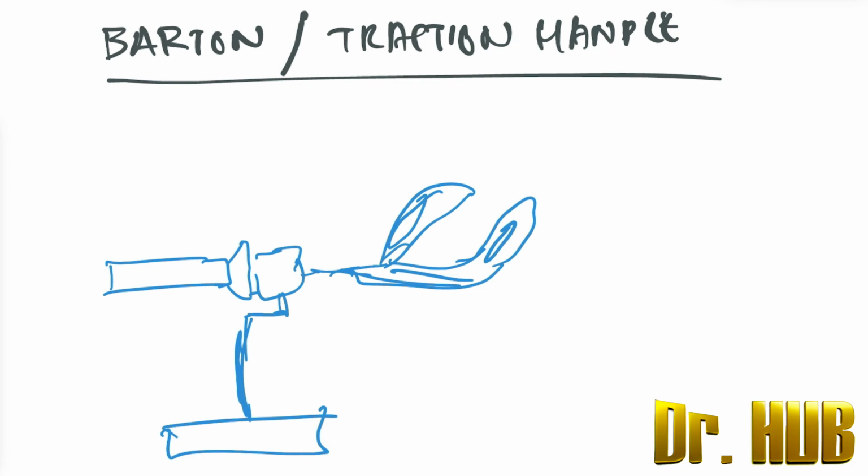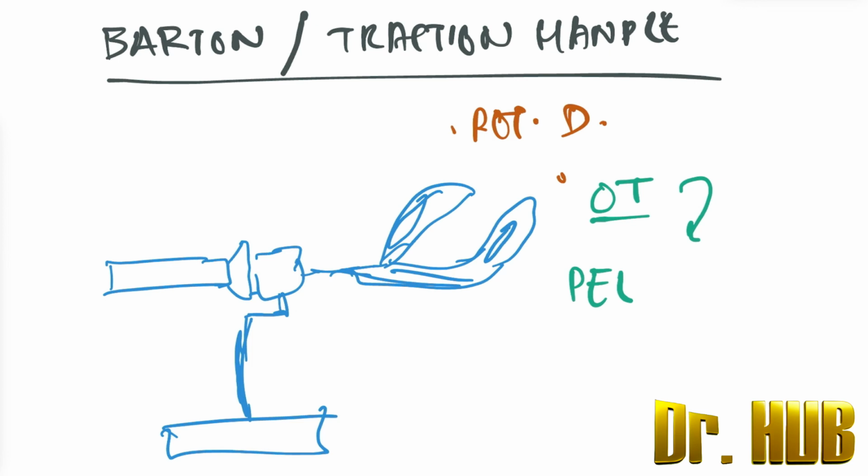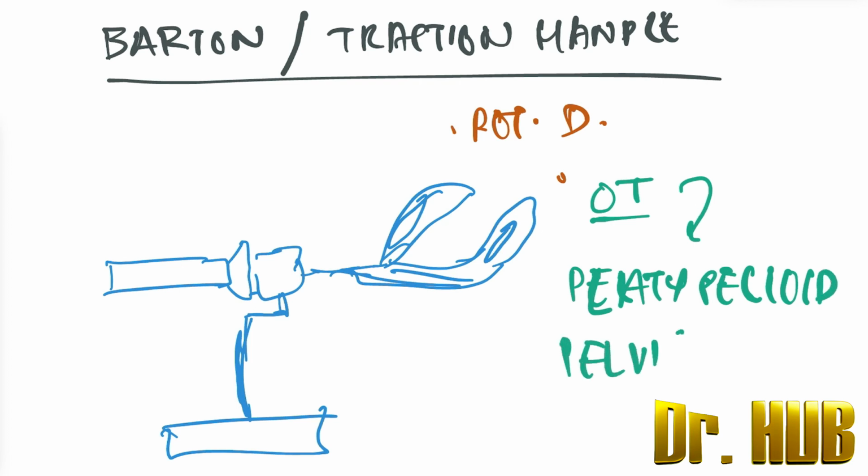It is used for rotational delivery, and it is most importantly used for the delivery of occipitotransverse positions in the platypelloid pelvis, and it is an obsolete procedure.